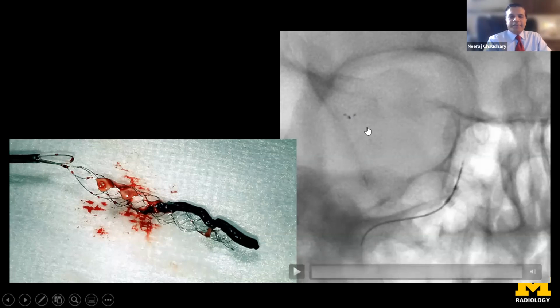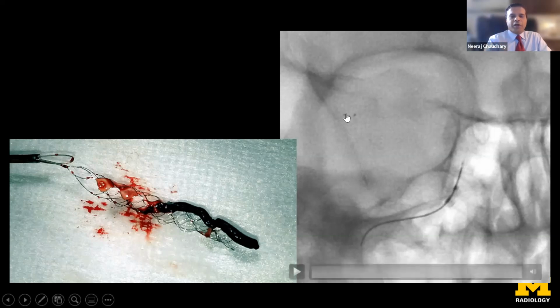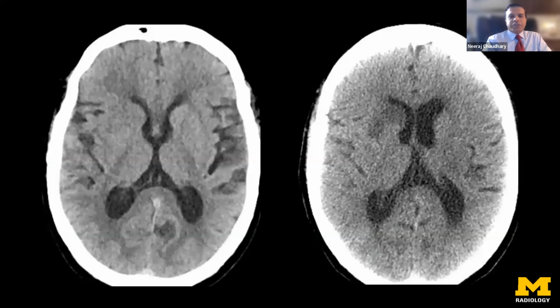The stent device itself is pretty radiolucent. And you can see these dots. This is the segment of the middle cerebral artery, and the dots are how you assess whether the stent is opened up. Usually they are a single point. And as it comes out into a vessel, it opens up and the spot becomes separated, and you get 3 or 4 radio-dense dots, which tell you that the stent has opened up well. And then we fix the clot somewhere in the middle of the stent, and then extract it with suction applied to the end of the catheters. So this is what we achieved.